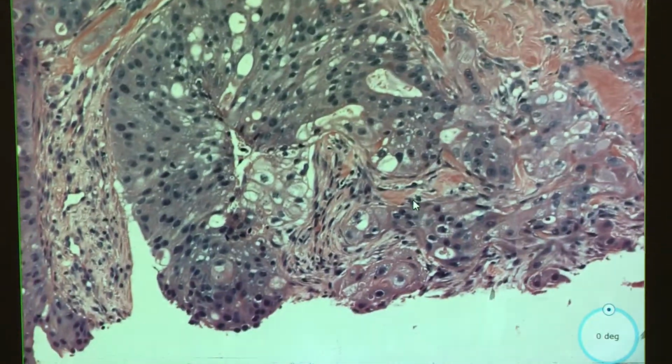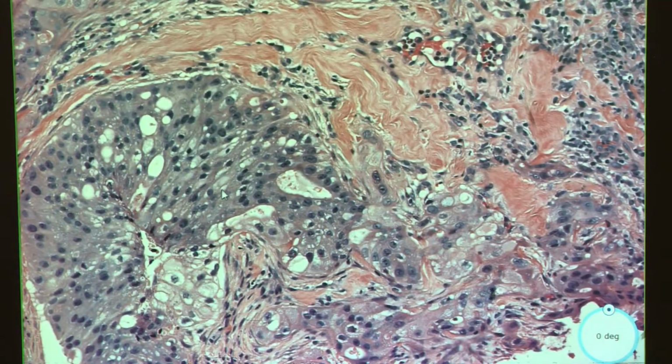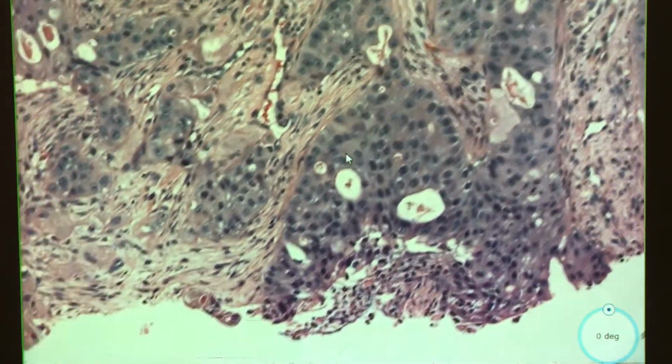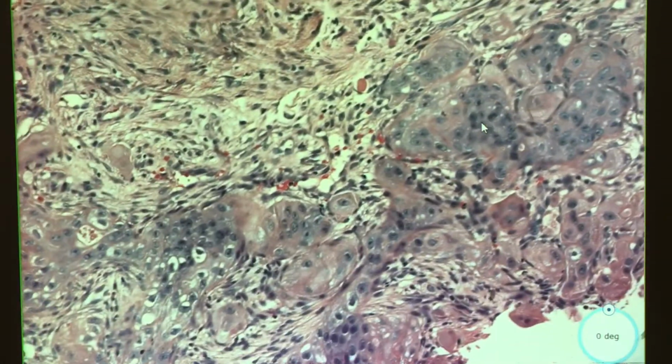I did also do a video of metaplastic carcinoma that was a squamous cell carcinoma. I think that one looked a little more squamous than this, but these look very squamous. But this would be in like the poorly differentiated at best.